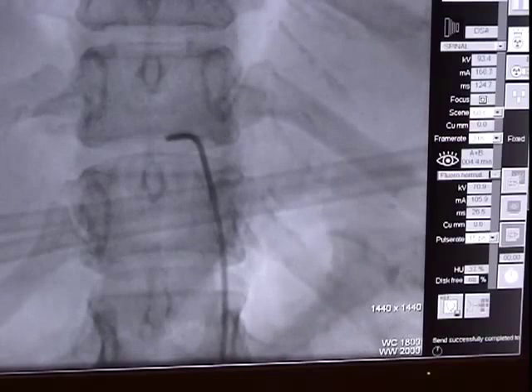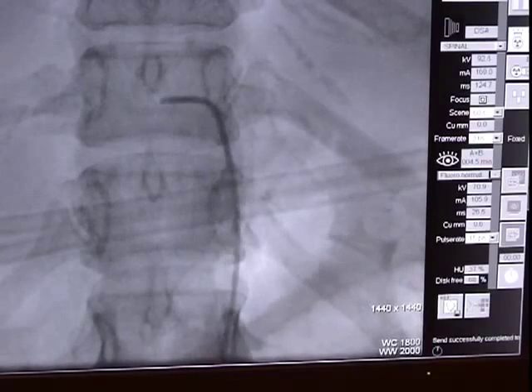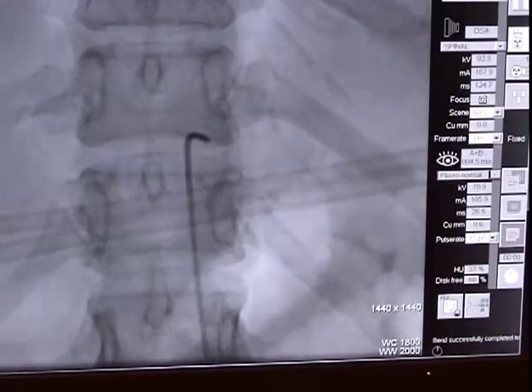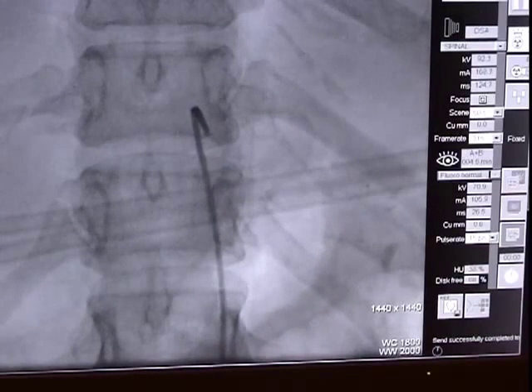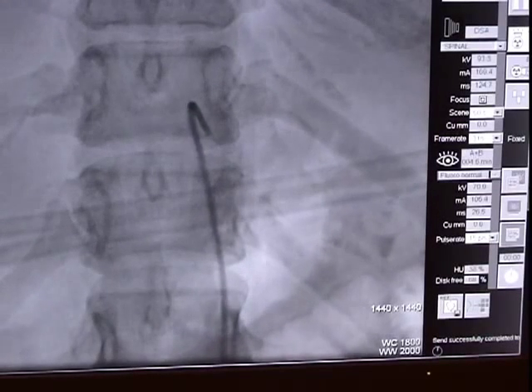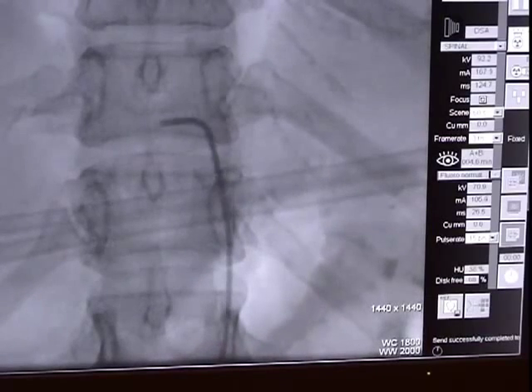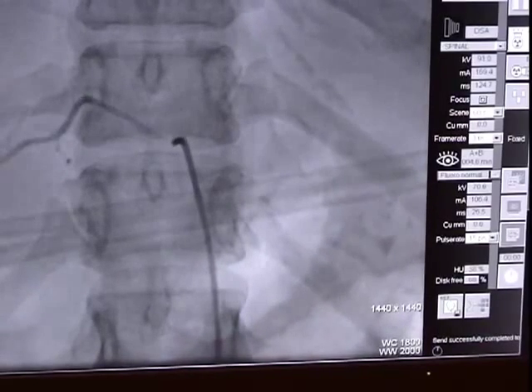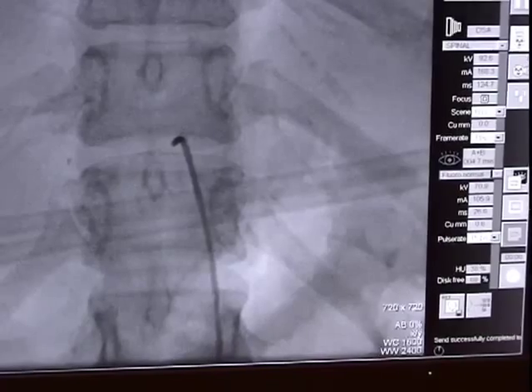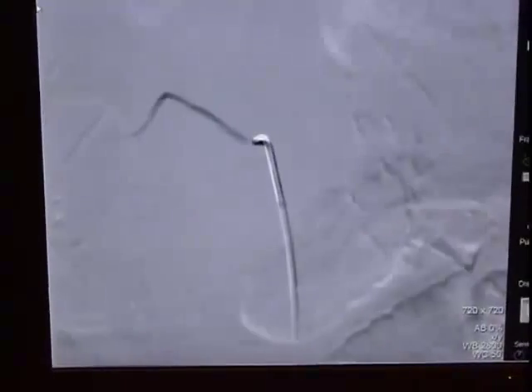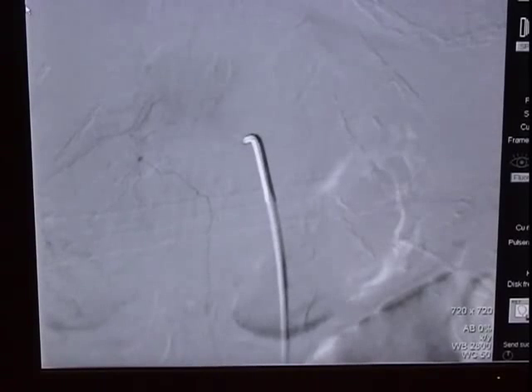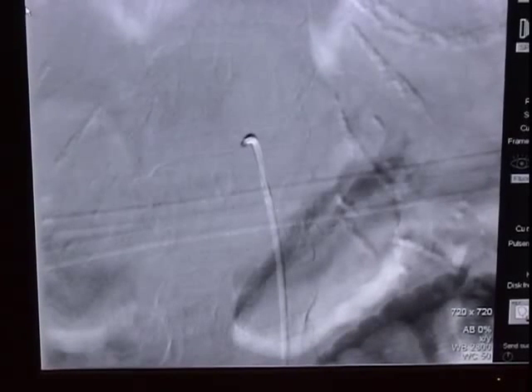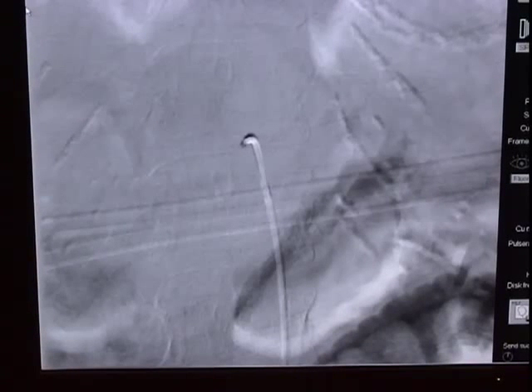Here the catheter is being manipulated and placed into another vessel. These manipulations and injections will be carried out 25 to 30 times in each individual vessel of interest until the study is completed. The entire study takes approximately 30 minutes. Thank you.